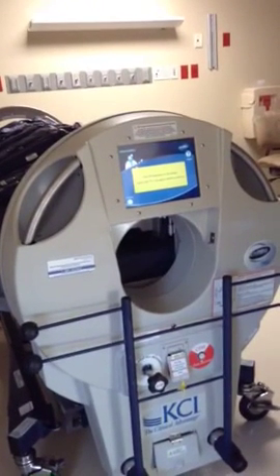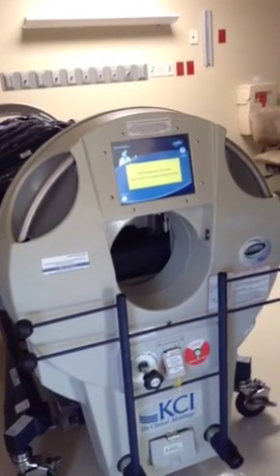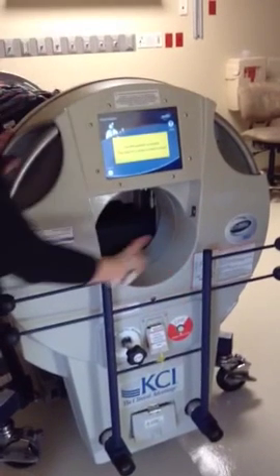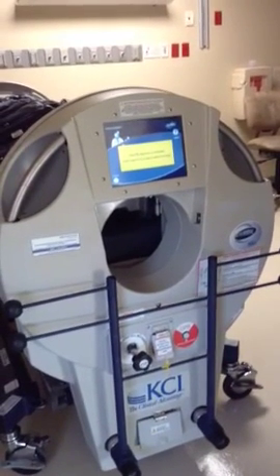They're prone. You keep getting that error. You cannot move them unless you do the emergency release. So if you press and hold, CPR will override your error and you'll be able to close the doors.